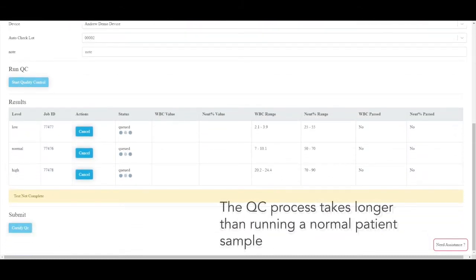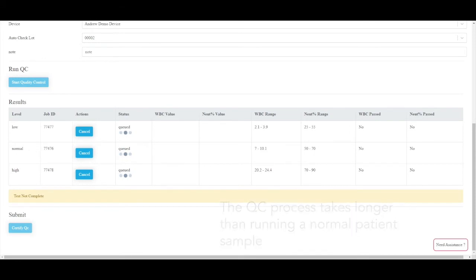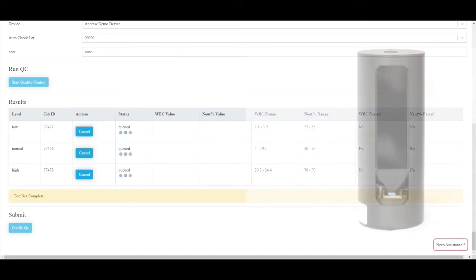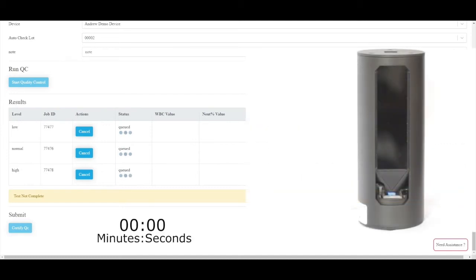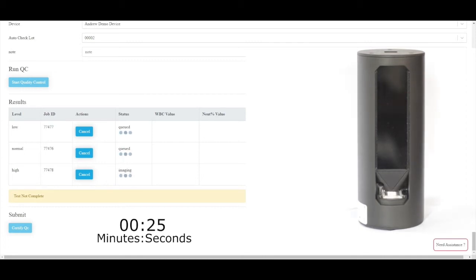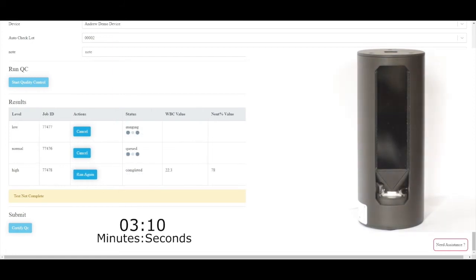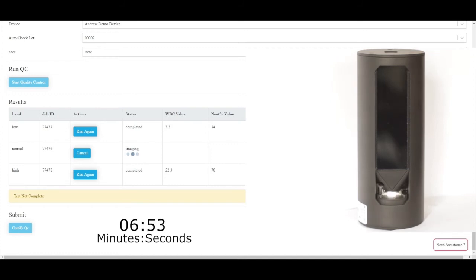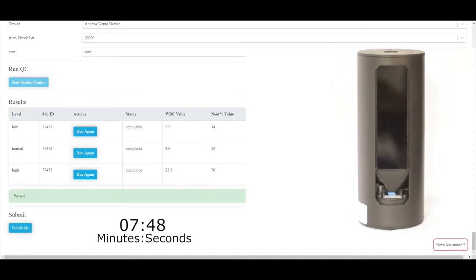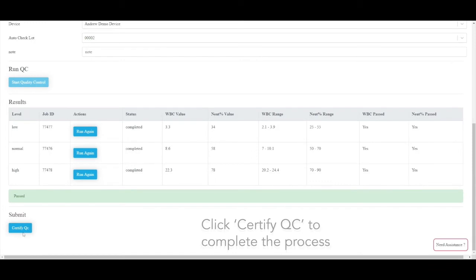The QC process takes longer than running a normal patient sample. Click Certify QC to complete the process.